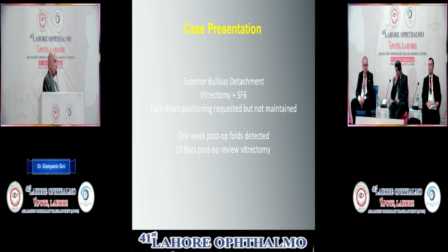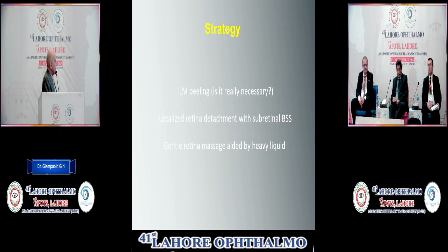a revision vitrectomy was performed. And this is essentially the strategy behind it. I performed an ILM peeling. I must say that I had not done many before. Actually, this was my second case. So I did an ILM peeling, and then I asked myself, is this really necessary?